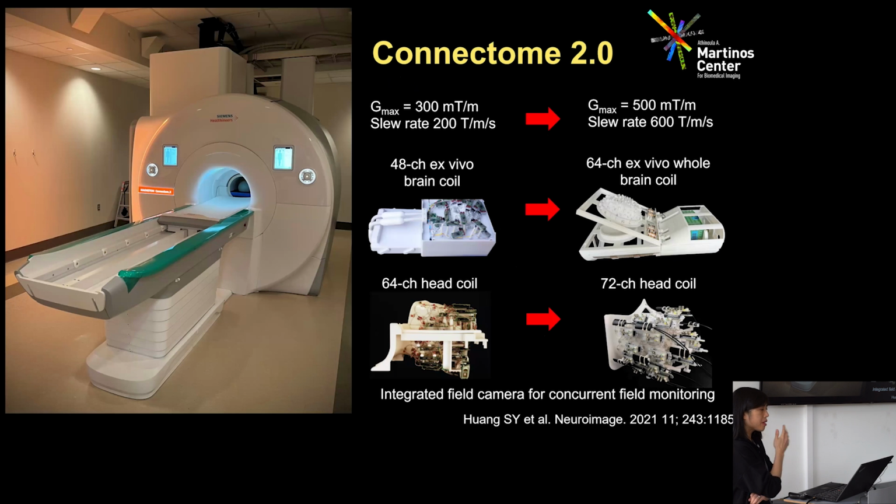So this is basically the Connectome 2 scanner. This was installed at the MGH last summer in July of 2023, and we were basically operational as of August 2023. You can see this picture is pretty new. This is when it was brand new, the plastic still even on the railings on the table.